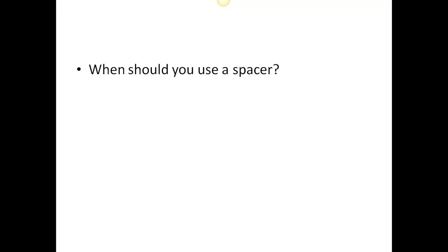When should you use a spacer? Definitely they are more recommended with corticosteroids as a way to decrease the oral deposition of the medication. Again, if we're delivering a steroid, we're going to have the patient rinse their mouth, but we also will use a spacer for almost every patient that we are administering an MDI within the hospital, because we find it improves deposition of the particles.